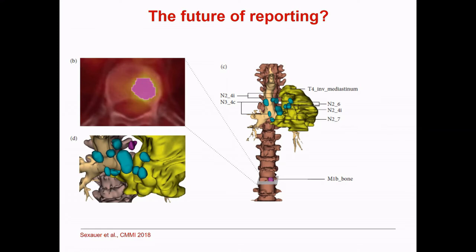We are now working on ways of combining first identification of these lesions and structured labeling, so that we can take even more out of these 25 minutes, so that people wouldn't have to segment the lesions completely, but would have to find them completely.